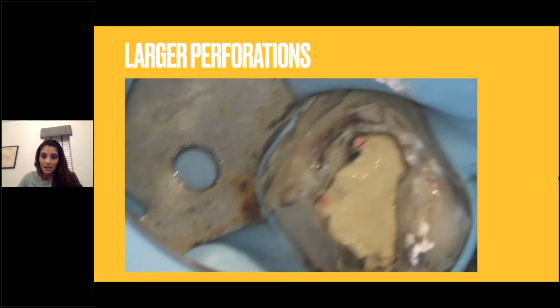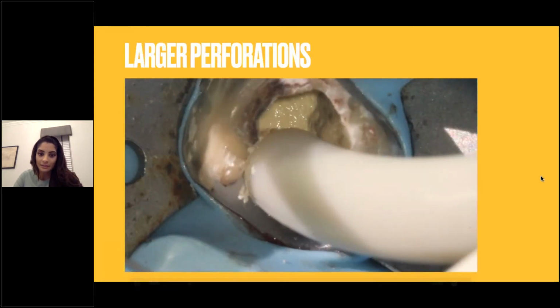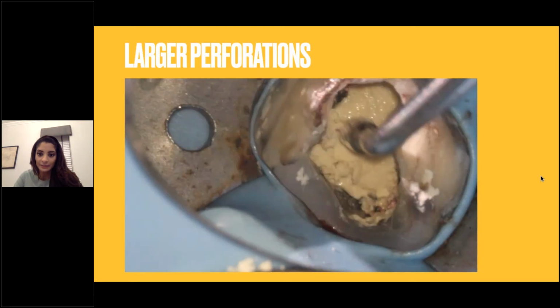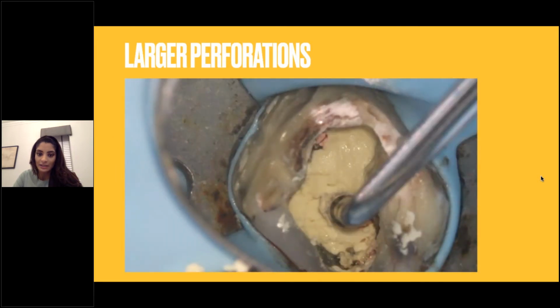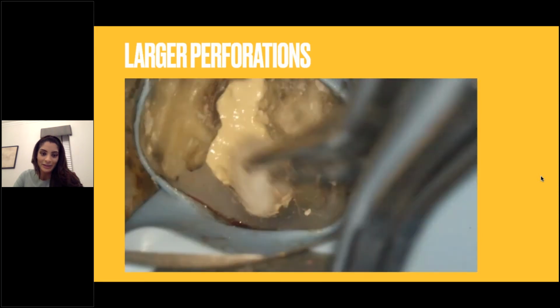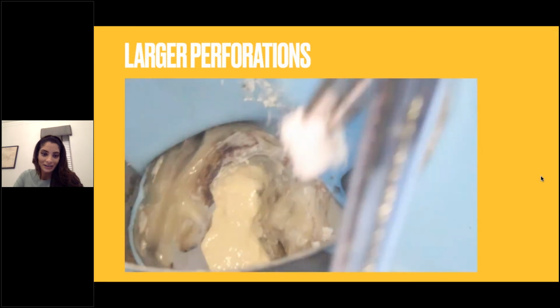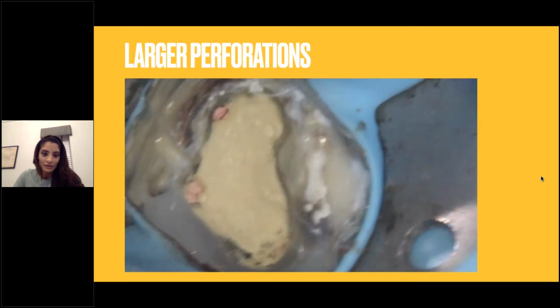Now I've got a short video. This is the initial layer of Biodentine that's already been placed. It was difficult to get hemostasis here. This is an amalgam plugger delivering the next load of Biodentine. So I'm not packing at all. I'm just very gently pushing the material to the sides. This is a little bit heroic. I wouldn't expect people to mend perforations of this size all the time. It was a very heroic case. I'm just using a cotton pledget here to manipulate the material along the walls. This is after 12 minutes.